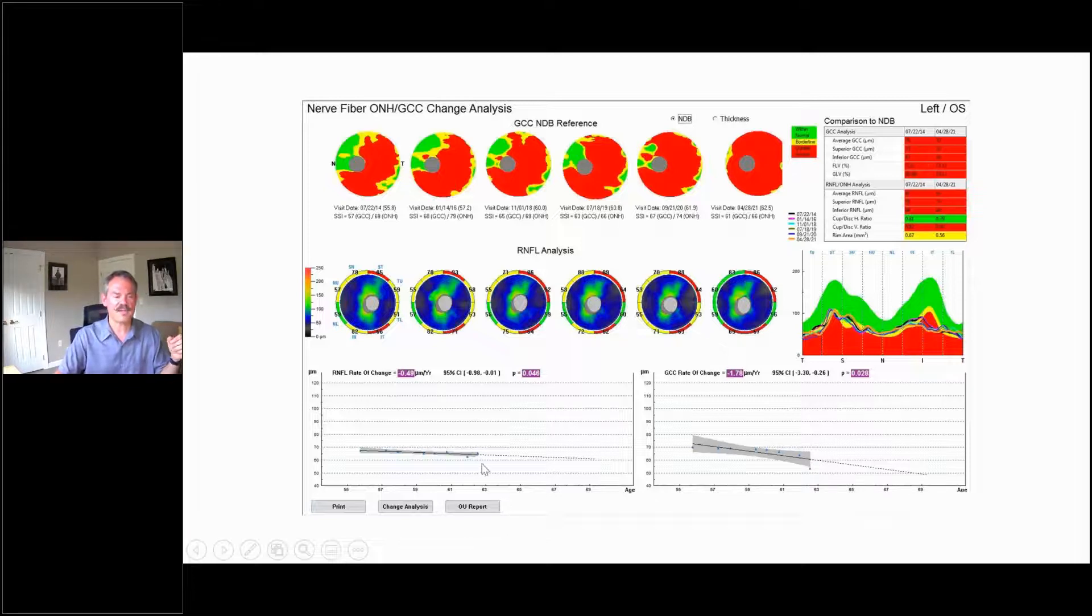Again, we're not sure about that because we're at floor, and the nerve fiber layer in the left eye is being flagged. Those are all things we have to be careful about.